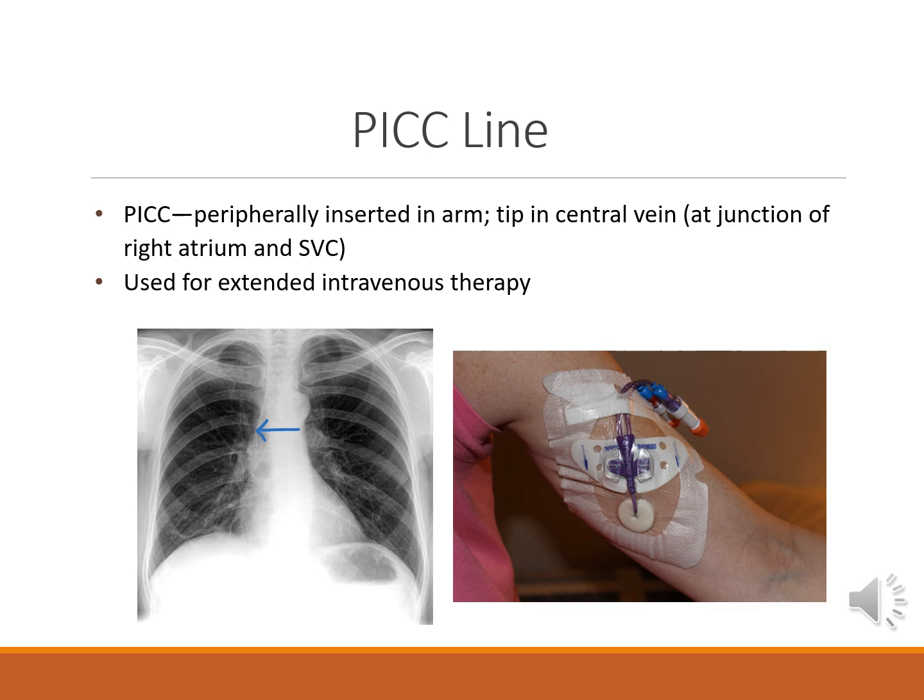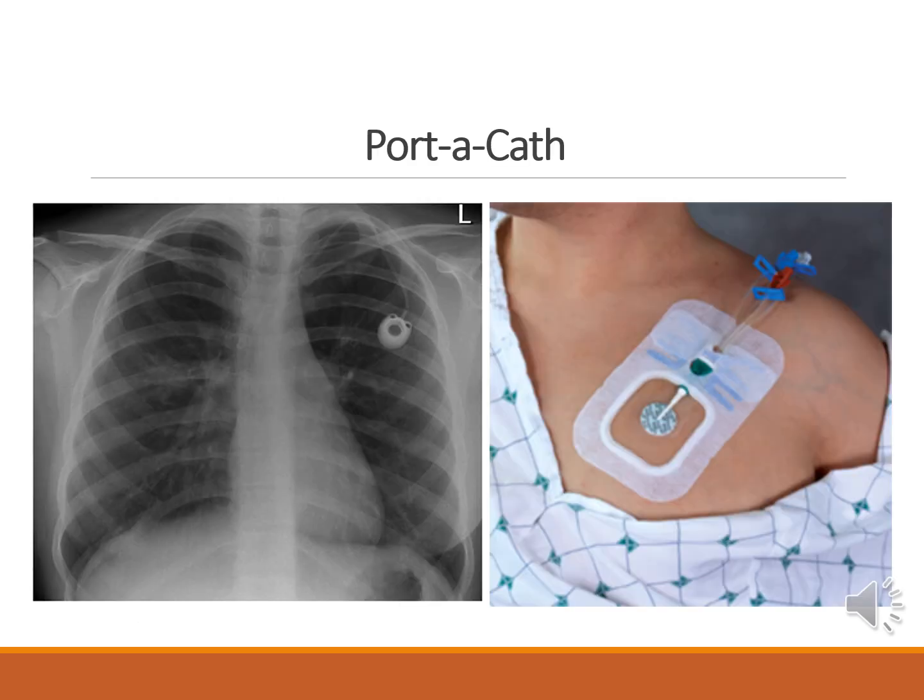An implanted port or port-a-cath is used for patients needing long-term intravenous medications or transfusions. It consists of a small device implanted under the skin, usually in the chest, which connects to a catheter in a central vein. The port allows for easy administration of fluids, blood, and chemotherapy, as well as taking blood samples. It remains in place for years, requiring less frequent needle insertions compared to the use of a PICC line, and should be handled gently to avoid applying any type of pressure to the area.